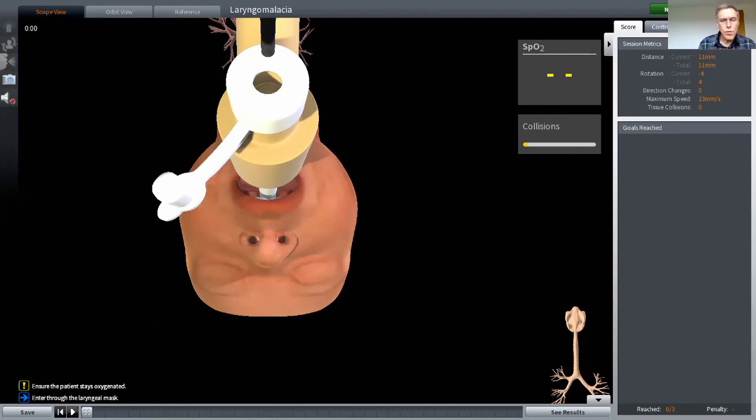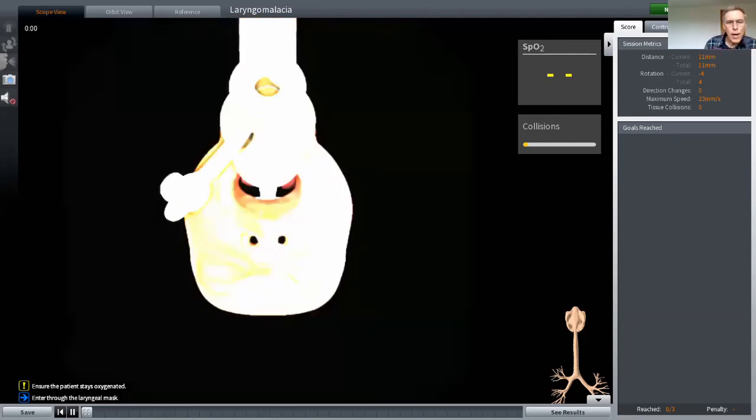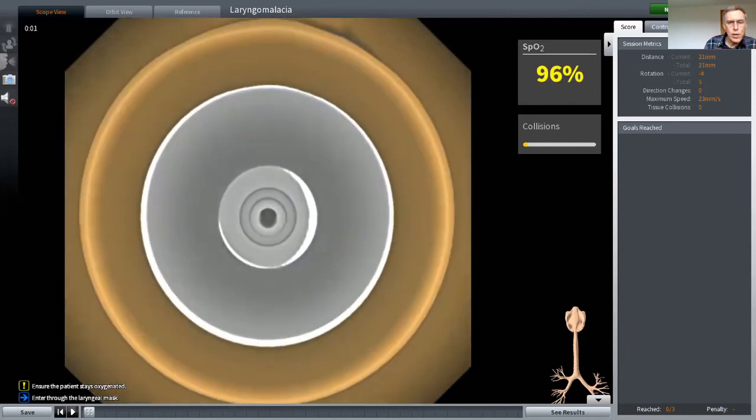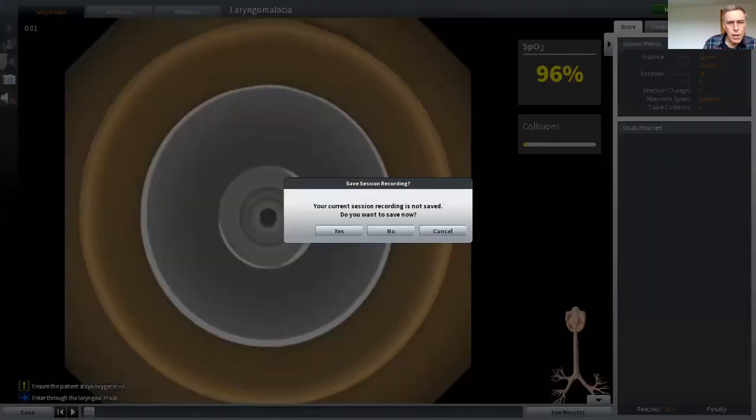Everything I've done was being recorded, and if I wish I can play it back. That's great for teaching. You can, if you're the tutor, you can review what your student's done and play back and critique what happens.